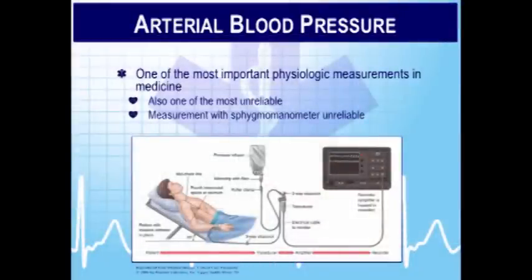Should always put saline on there. Yep. Some old school places will put a little bit of heparin in the saline bag, but you wouldn't want to use anything that contains dextrose because dextrose is sticky, and after a while it's going to kind of muck up the function of the little diaphragm inside that transducer. Okay. Also cause the line to clot off. So that's basically how it's set up.